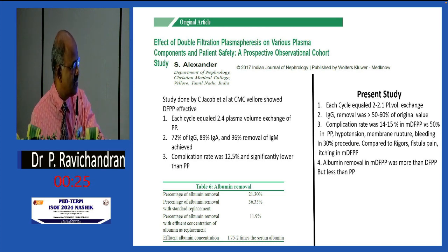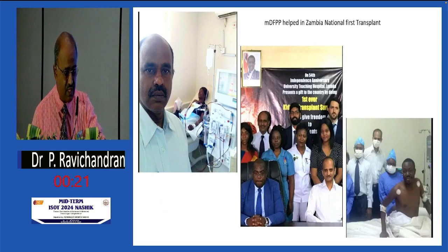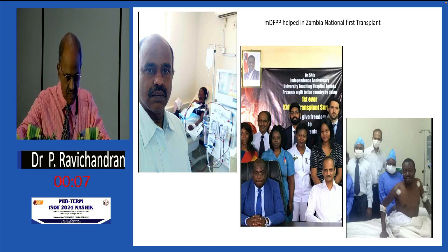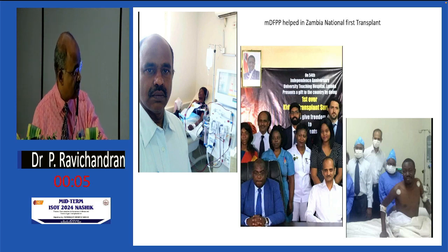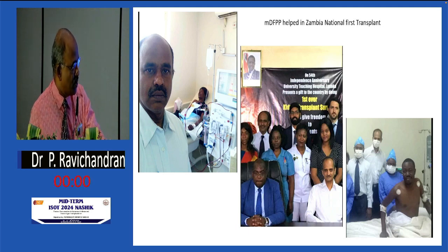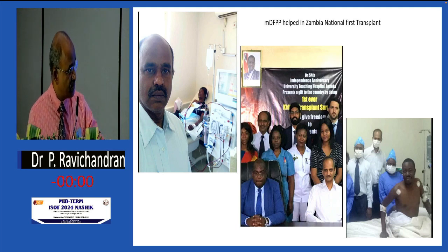And with plasmapheresis, our complication rate was 50% compared to 14% in the present study. So this procedure was very useful, where we could use it even in Africa. This was the first country transplant we did in 2018, where less facility was available even to do a cross match, or we do not know the immune status prior to that. So we use it as a routine procedure, or if you send it to South Africa, we can get it done through them.